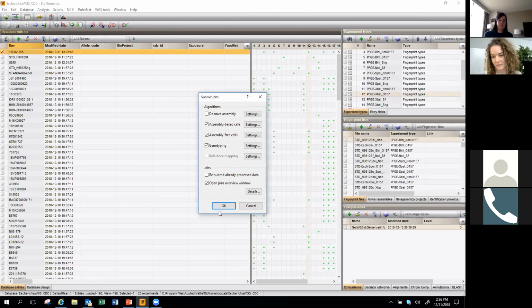Yeah, so we are currently deploying the software to the states, but right now it's only for PFGE use because we're still finalizing some of the tools. As you can see, there are a couple of little buggy things that we are in the process of working out, which should be worked out very soon. We're also having to reanalyze all the sequence data that we have accumulated over the last couple of years from your sequences. And once that is all finished, then we can open it all up to the rest of you.